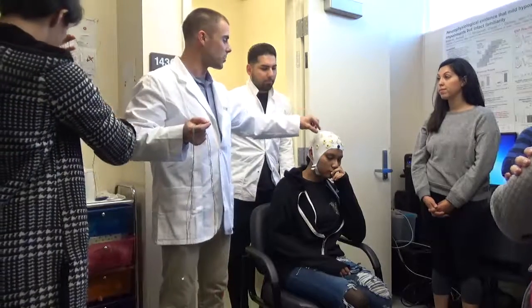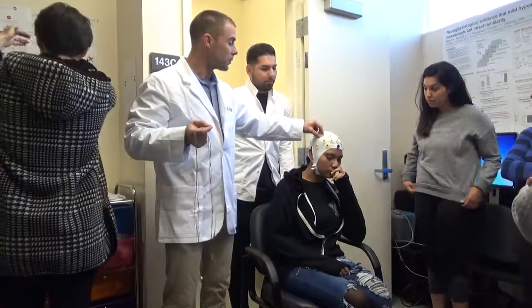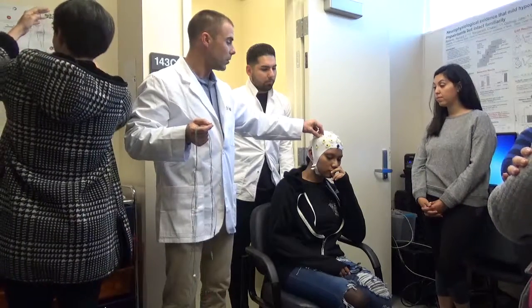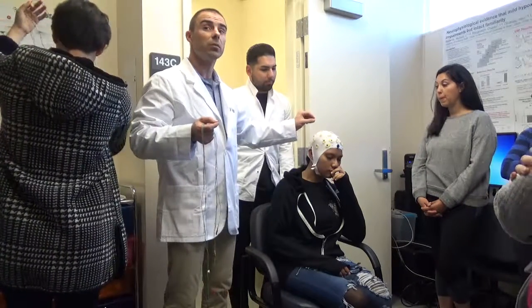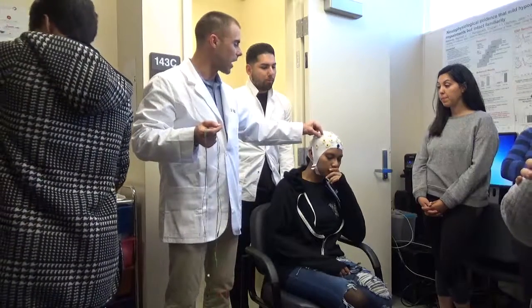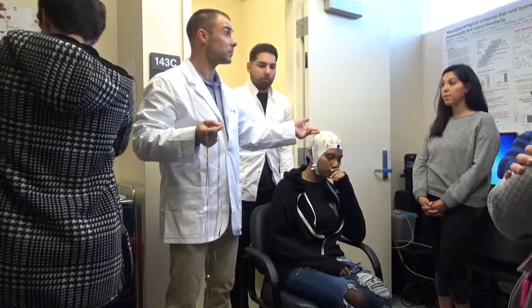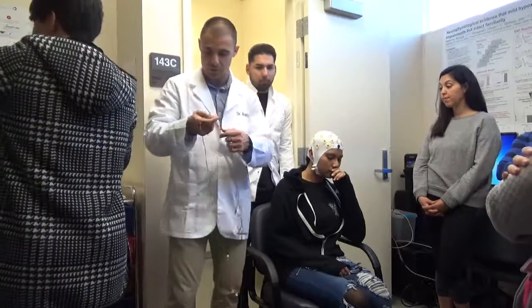So we'll get to that when we start filling these in with gel. We'll learn that just a little bit of gel, or there's a healthy medium, and you want to kind of hold the capsule down so that the gel doesn't leak out the sides. And so we'll work on the technique on getting that.